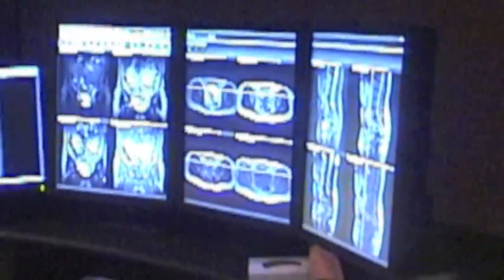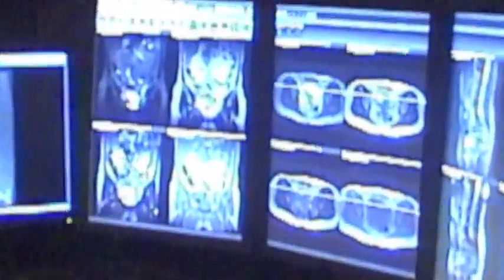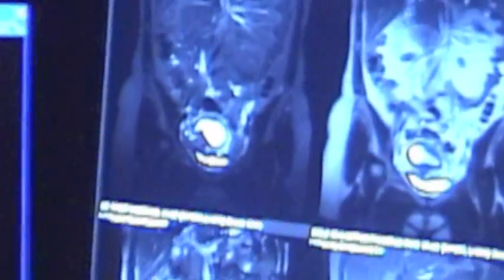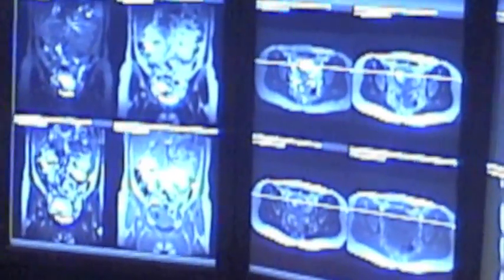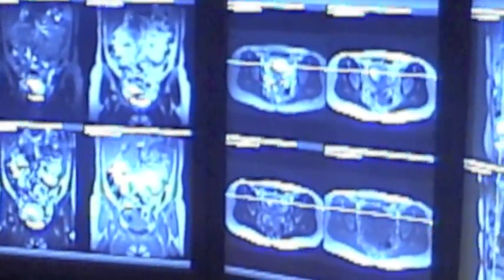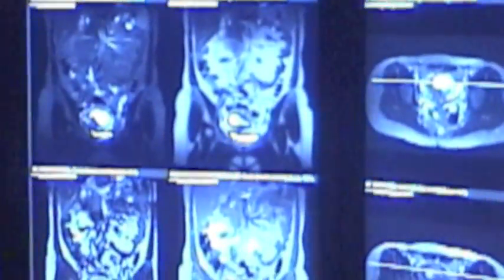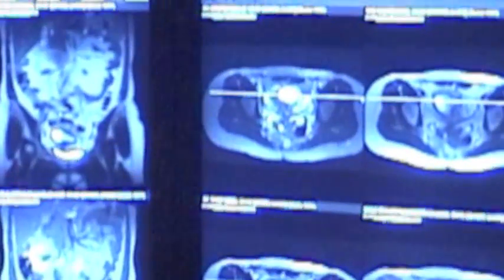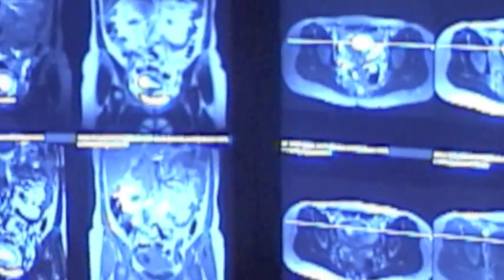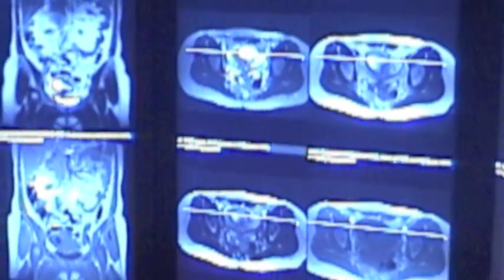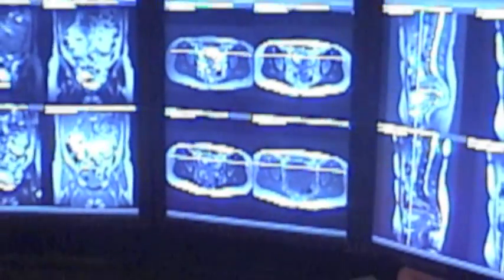We have a standard series of five sequences utilized for all cases. They are acquired in three planes for the first four sequences, and then one coronal plane of diffusion. The sequences are inversion recovery single-shot T2 (Haste IR), single-shot T2 (Haste), in and out of phase T1 Flash images — I only read the in-phase images because the out-of-phase images have etching that can be problematic for appendix evaluation — and steady-state True FISP images.